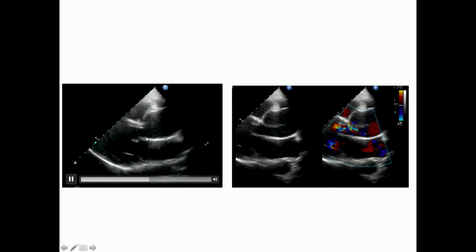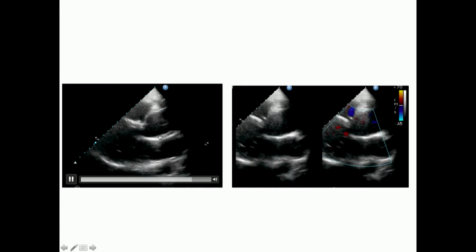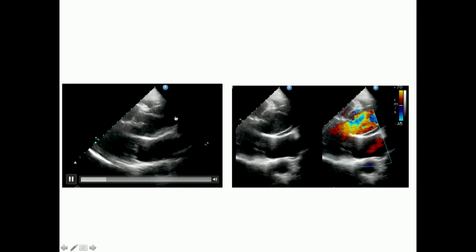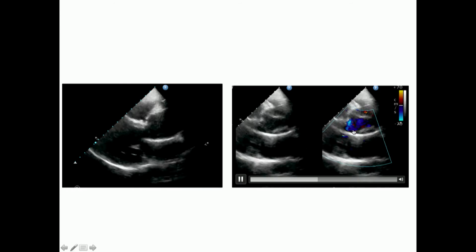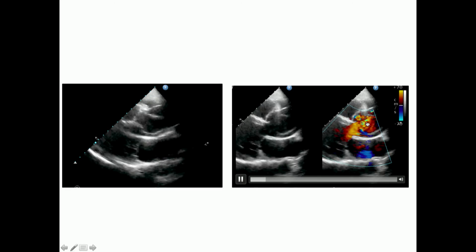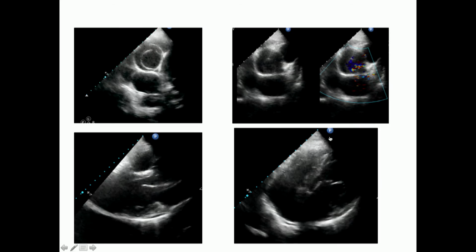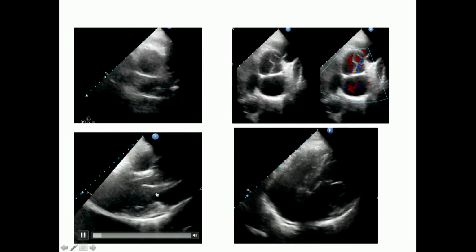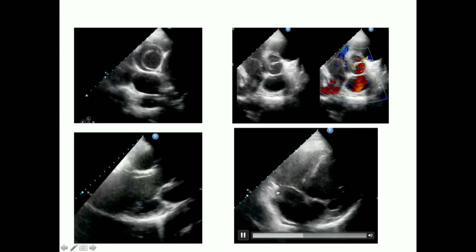In transthoracic echocardiography, which I did with the patient sitting on the stretcher, I could see the intimal flap, which was causing the AR because it was prolapsing through the aortic valve. The valve was normal. The true lumen and the false lumen could be easily seen. I could visualize the coronary arteries, and I could see that there is no wall motion abnormality in the heart.